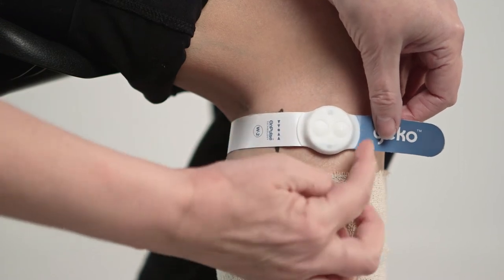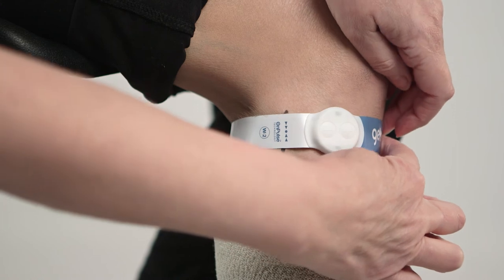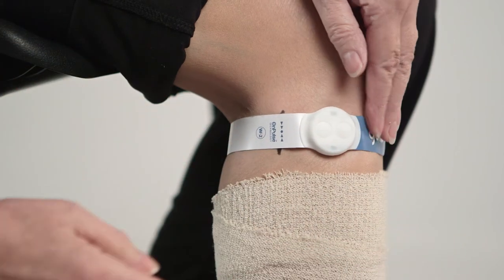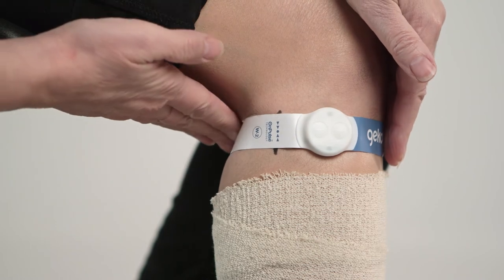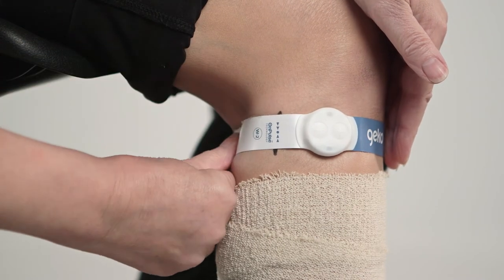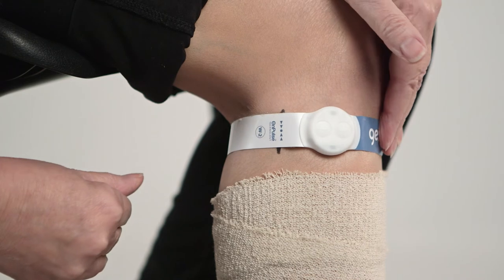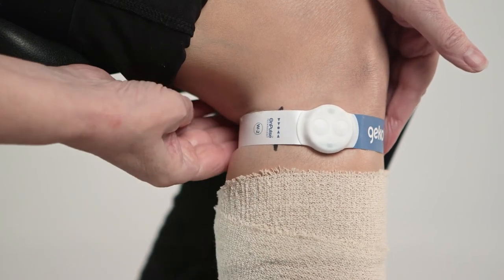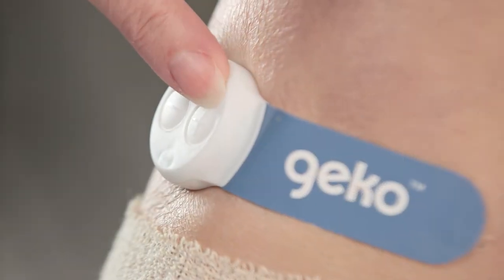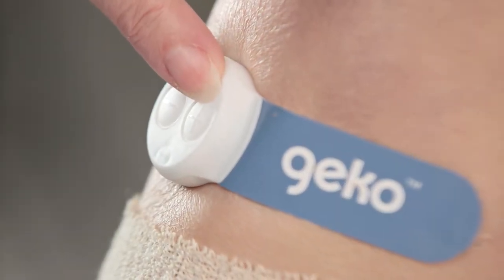Retain the backing card for storing the Gecko device between treatments. Correctly fitted, the blue branded short end of the device is positioned to the front of the knee, with the long end wrapped around to the rear of the leg, below the crease of the knee. This will place the negative electrode over the common peroneal nerve and positions the plus button to the front of the leg, whichever leg the device is applied to.